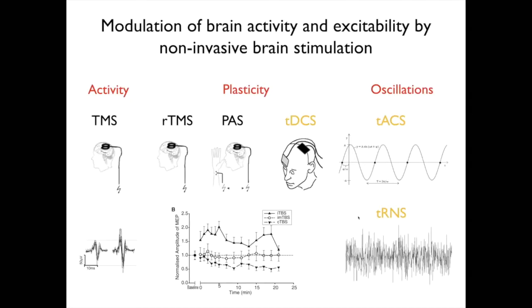So for the mechanistic foundations of transcranial electrical stimulation, this belongs to the family of non-invasive brain stimulation, which includes mainly TMS and transcranial electrical stimulation. A couple of techniques are available.